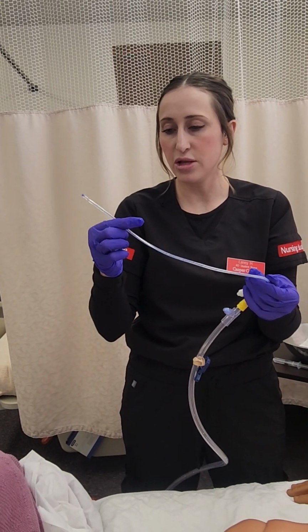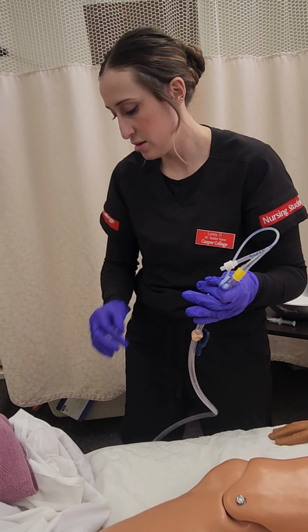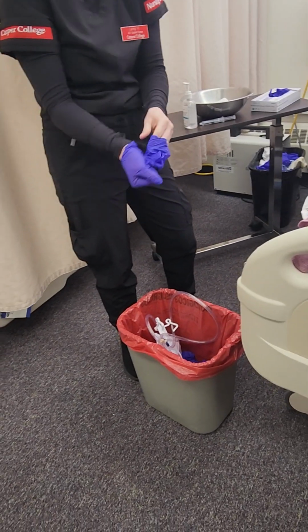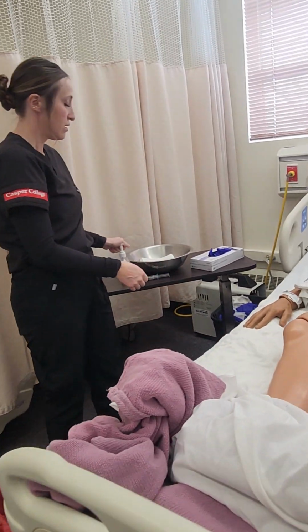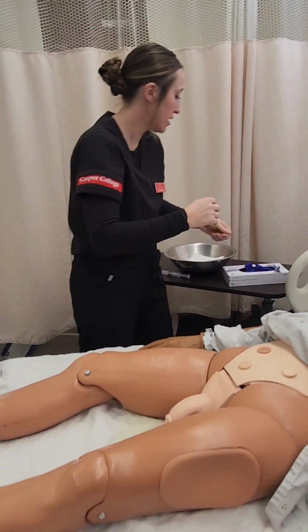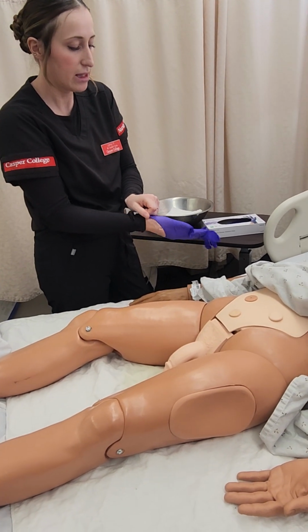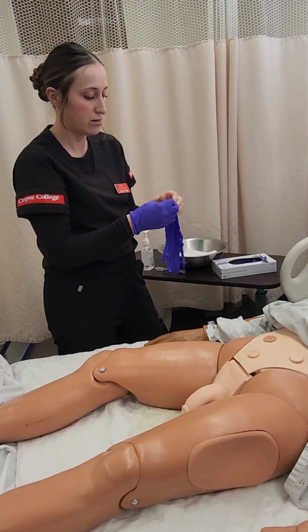parts, noting any blood, mucus, or any discharge on the tubing. Then I am going to take these and put them in my red bag or dispose of them per facility policy. Dispose of my gloves, hand hygiene. All right, I'm just gonna clean you up a little bit. Okay. And then we should be done. It looks like your chuck is a little wet, so I will come back here shortly and place a new chuck under you. Okay.